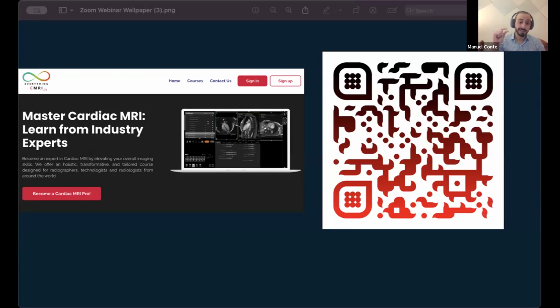No, sorry, maybe it was a mistake. If you decrease the slice thickness, you reduce the through plane artifact. Maybe I mentioned it by mistake, but it's good to decrease the slice thickness. Just keep in mind, if you decrease the slice thickness, you also decrease the SNR. So you get more grainy images, and you need to compensate for that with other parameters. But yeah, my recommendation is to use 4 millimeters. Well, it depends on the clinical indication. But if you decrease the slice thickness, you decrease the through plane distortions.